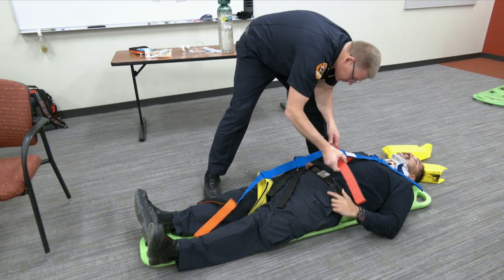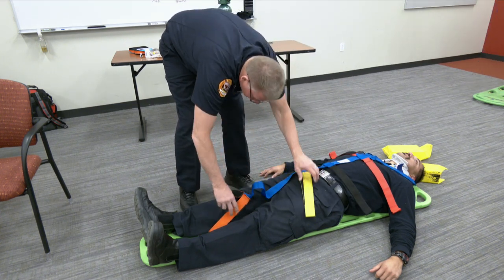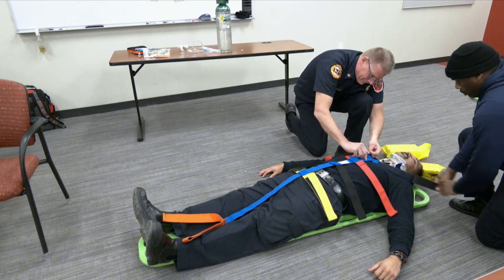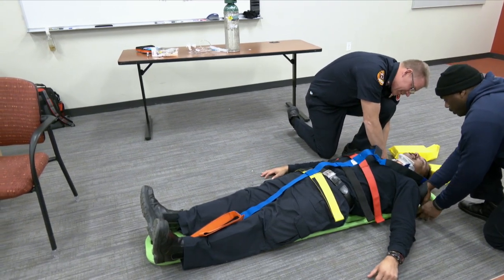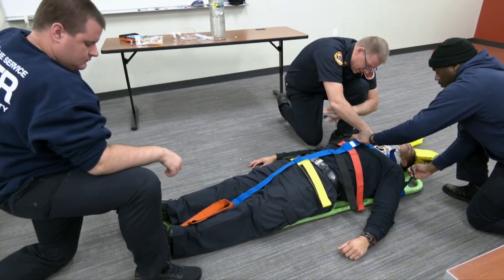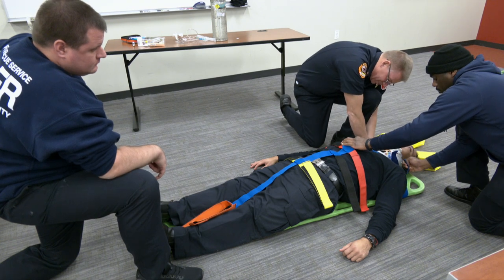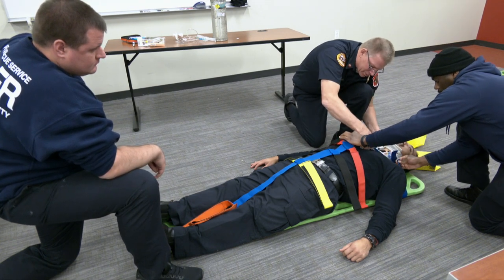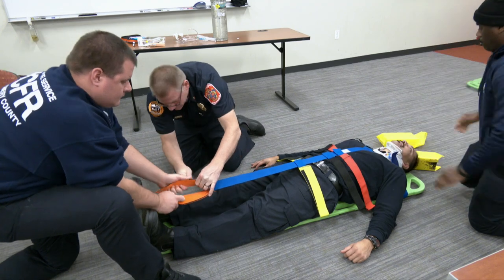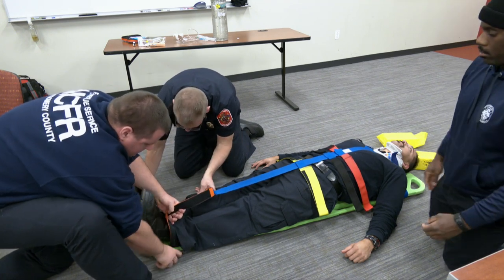Alright, so this strap goes here, this one goes here, this one goes somewhere in this neighborhood, this one in this neighborhood, and we'll do this one right here. Let's go ahead and strap these in. If we can, we want to go slightly underneath the patient's shoulder — because it locks them in. Not up high, because we've got head blocks going there. So we go just below where the head blocks would come in, to wrap their shoulder up. Then we go down to the feet, getting as low as we possibly can.